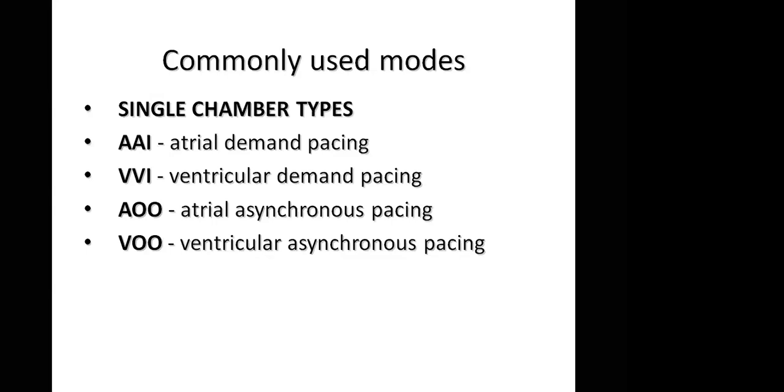Technically, they said you don't bother using AAI anymore. That is archaic. But there are indications for it, actually.